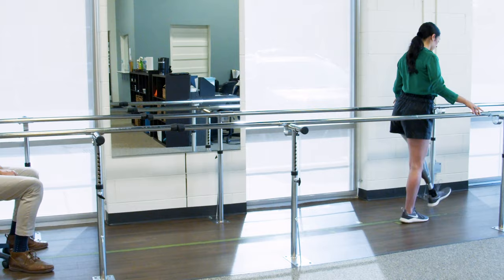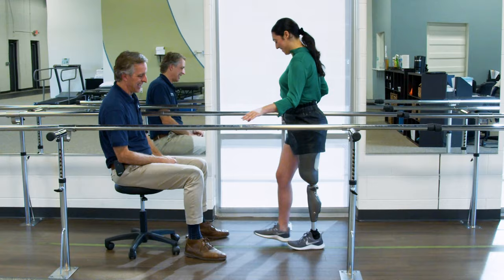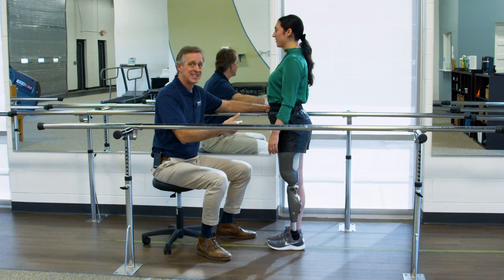So it's almost like a popcorn drill as well. She is basically going pop, pop. Keep it down, keep it down. Good, hold up right there. As you can tell, this is not easy. She's an accomplished walker, and this is not an easy task to work on.